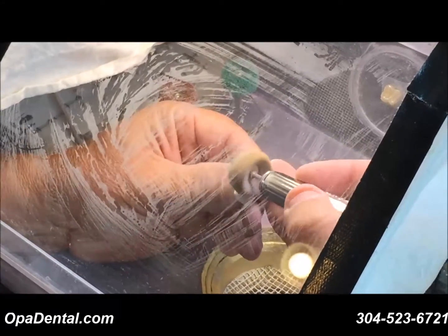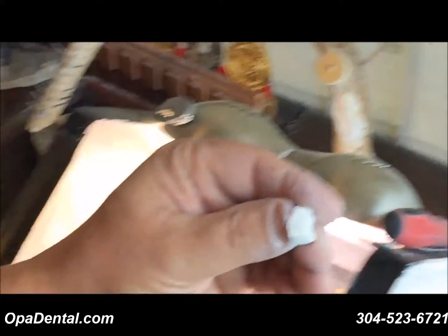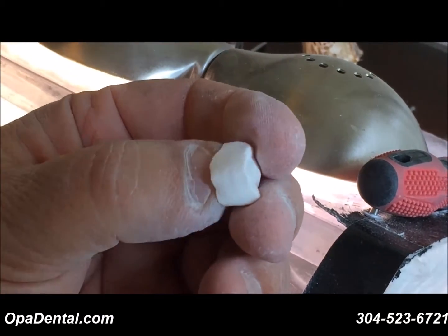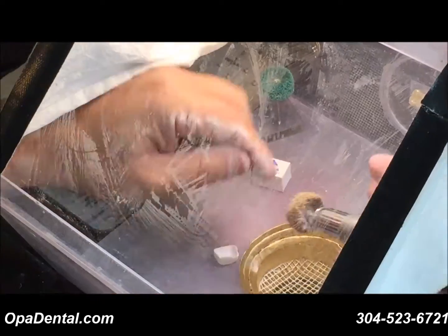And that's about it on the coarse. You can see it took out all the gross grooves. I could take a little more, but next I'll use the medium.